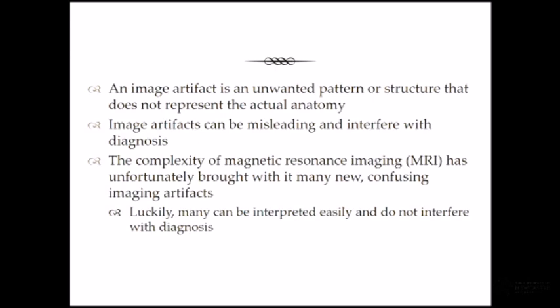And if you as the radiographer are aware of that, when someone says to you, you didn't scan high enough, you go, actually I did, that's an artefact. You just didn't recognise it as that. That's an example of understanding the principles behind acquiring the images, you'll know what that means. So image artefacts can be misleading and interfere with diagnosis.